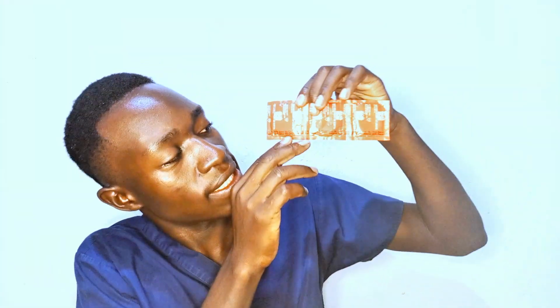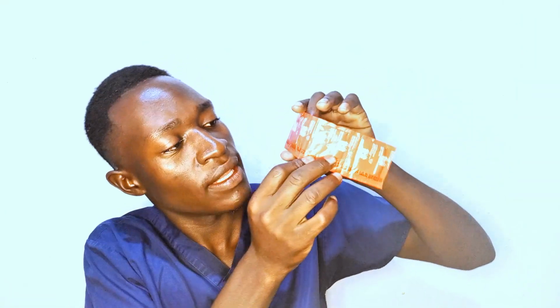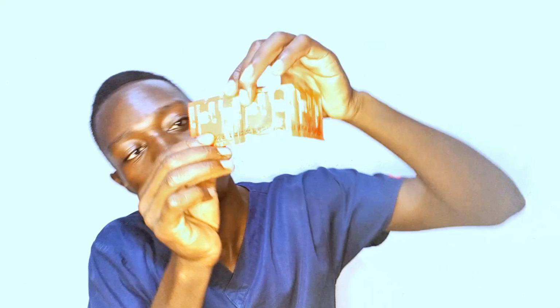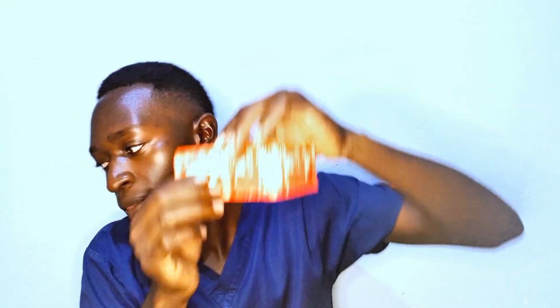We find that it is written here in black. I don't know if you will be able to see this black here. It was manufactured in June 2022 and it will expire in May 2027. Also, on this one, where is the expiry date? Yes, it is here in white.